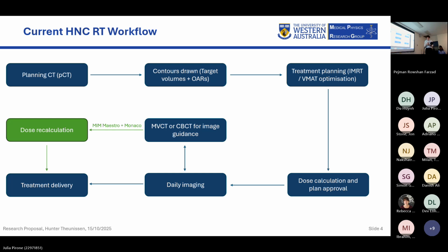And so, yeah, at Genesis Care, we explicitly only employ a CBCT. However, a lot of the studies we investigate still use MVCT, given they are either older studies or in different nations where the standards aren't necessarily as high or the technology isn't as rapidly advancing as it is in Australia. So usually the patient would then be guided, given the CBCT, and then they would be treated.